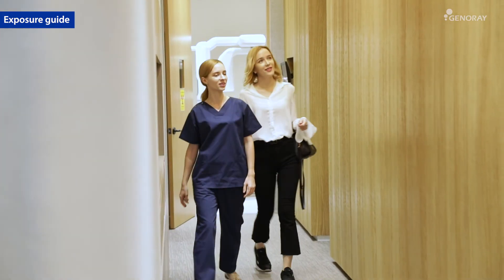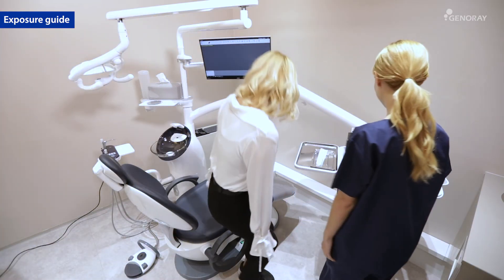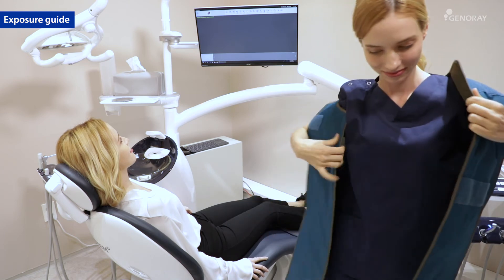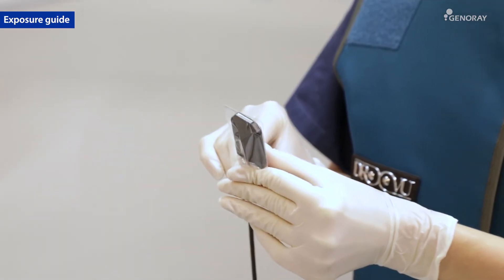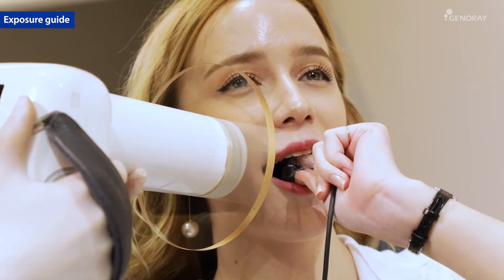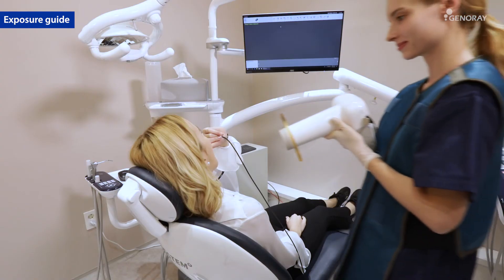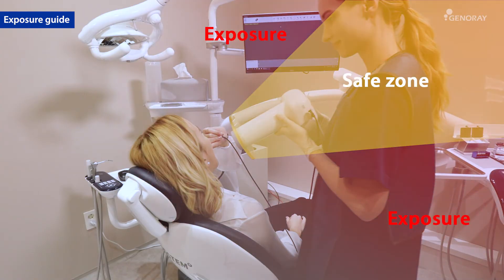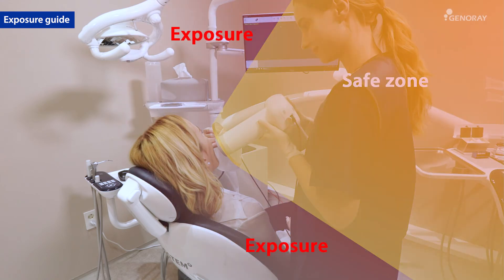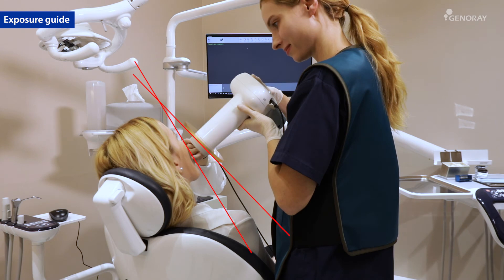Take the patient to the dedicated area. Clothe your lead apron for safety purposes and place the intraoral sensor on the proper area of the tooth to expose. Aim the beam limiting devices of the equipment exactly where to expose. Follow the exposure instructions on the next screen and match the angle between the sensor and the unit.